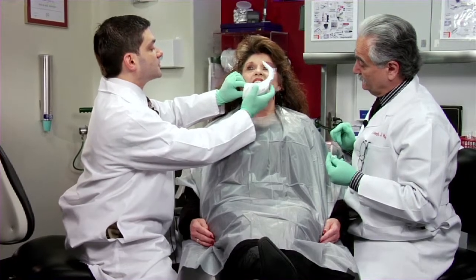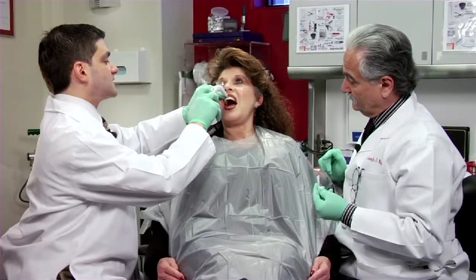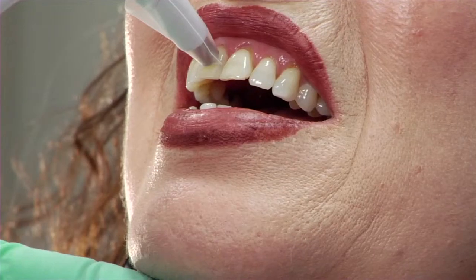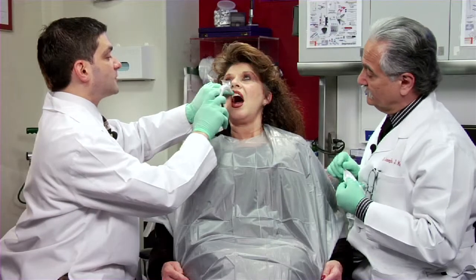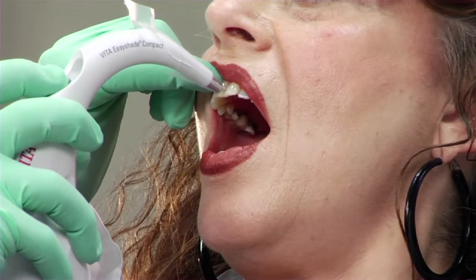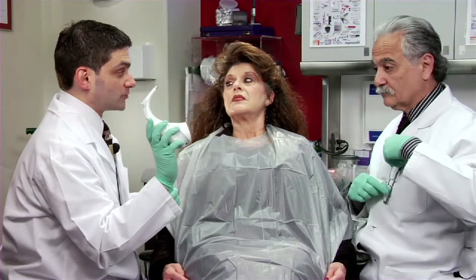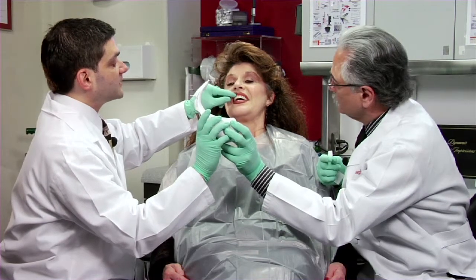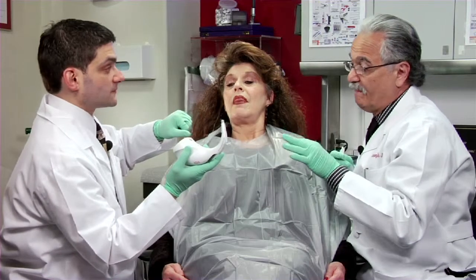We're going to start on number eight and take three shades. That's the cervical shade — the screen says okay. Then we go to the middle. It says okay. Now the incisal. We got our three shades — she's pretty much in the 2M group at the cervical and middle, and then at the incisal she's a little more toward the 3 group. Actually, if you look at her teeth you can see she's a little brighter toward the cervical than the incisal, which is usually the other way around, but that's what the device shows.